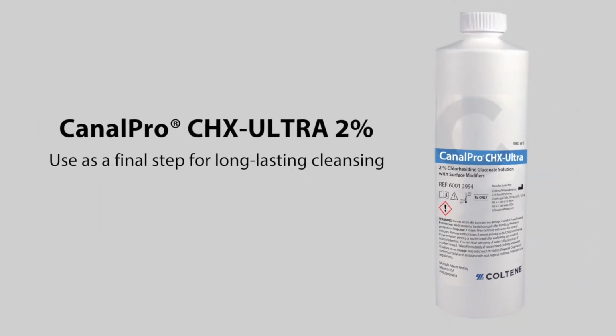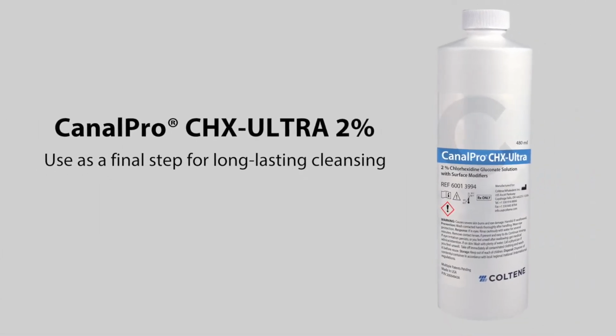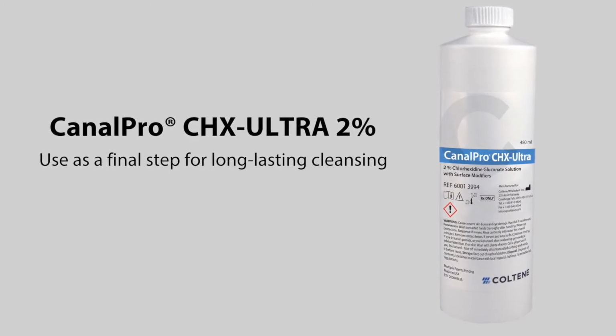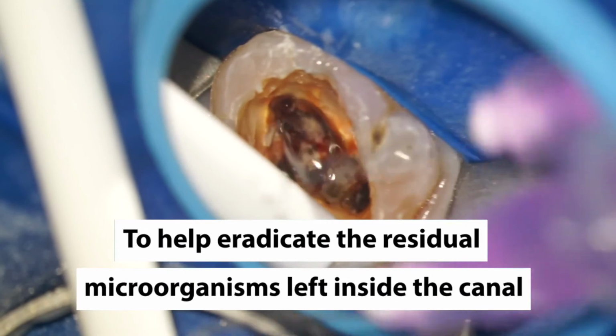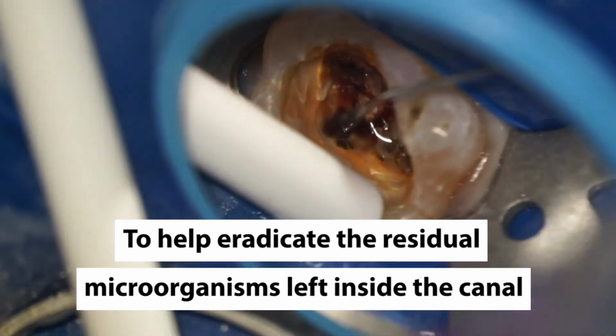Should you have a case with a large infection or a large radiolucency, oftentimes associated with a severely infected tooth, you could suggest that the practitioner use a final rinse of 2% chlorhexidine to help eradicate the residual microorganisms left inside the canal.